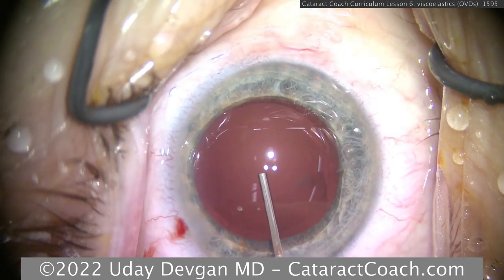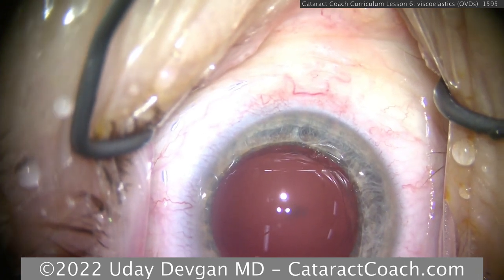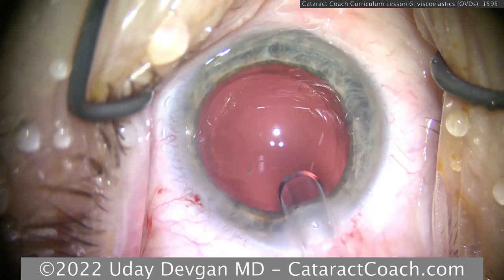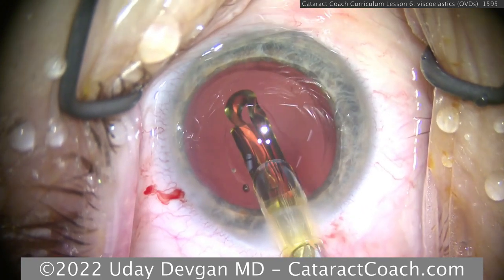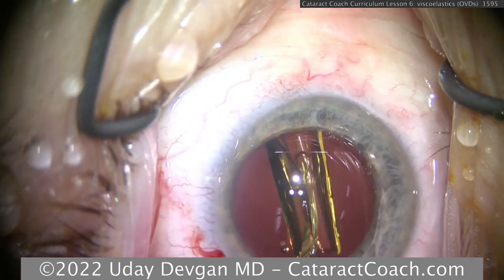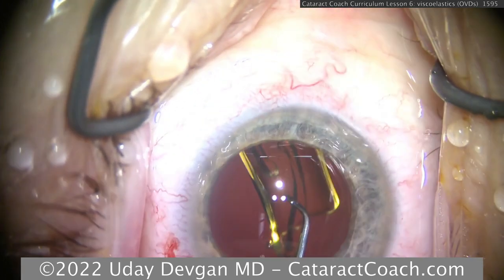Cohesive viscoelastic now being instilled in the eye to inflate the capsular bag. And now we'll get our lens. It's a single piece acrylic lens in this case. I'm going to deliver it right in the capsular bag. The cohesive here will come out quite easily, so it maintains space very well, so the bag is nicely deepened. So it's easy to implant the lens.